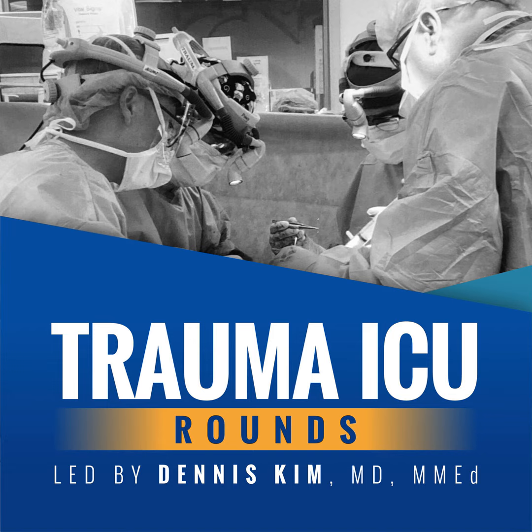As part of our assessment of readiness for extubation, for example, patients are typically placed on what's known as a spontaneous breathing trial, or SBT, which may be performed in a variety of ways. And one such way is called the T-piece trial, which involves disconnecting the patient from the ventilator while providing oxygen in a blow-by fashion via a T-shaped adapter that's connected to the end of the ET tube. And during such a trial, patients breathe spontaneously at their own rate and determine their own tidal volume without any assistance from the vent. So this is a spontaneous form of breathing, and as you can imagine, it's not the most popular means of assessing readiness for extubation.